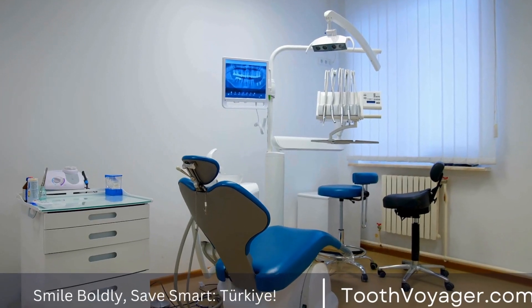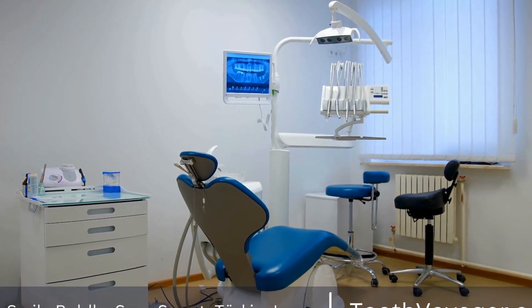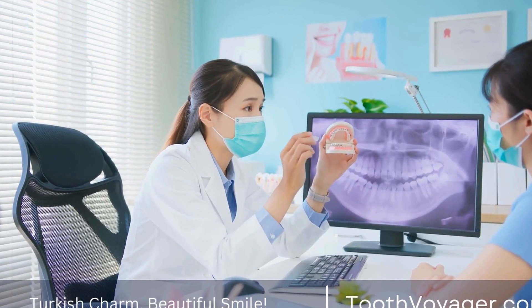Bonding: Once the crown is confirmed to be a perfect fit, it is bonded onto the tooth using dental cement. The cement is cured using a special light to ensure a strong and durable bond.